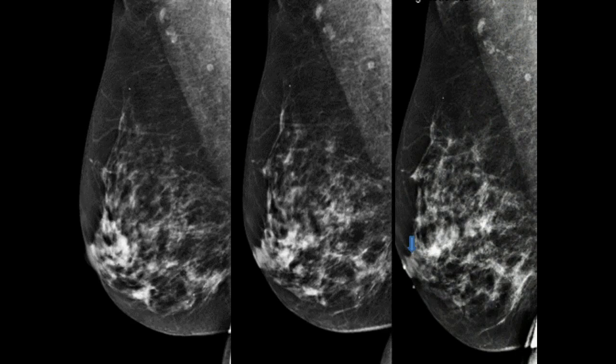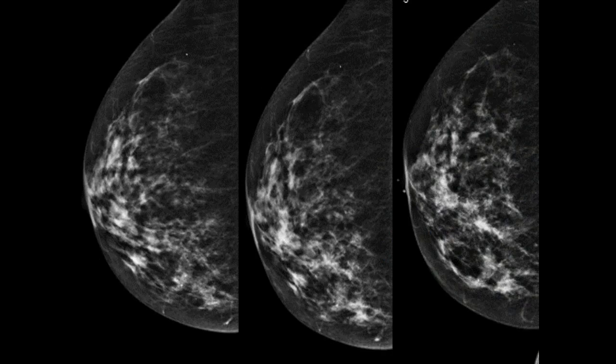Another potential use for contrast is in problem solving. This is a woman who came to see one of our surgeons with a 5-centimeter palpable mass. This is her mammo from 2014, 2015, and 2016. And the mammogram looks unchanged over 3 years without a discrete mass. The patient had had an outside ultrasound where they thought they saw something in this area where the palpable mass was most prominent. The ultrasound biopsy was negative.